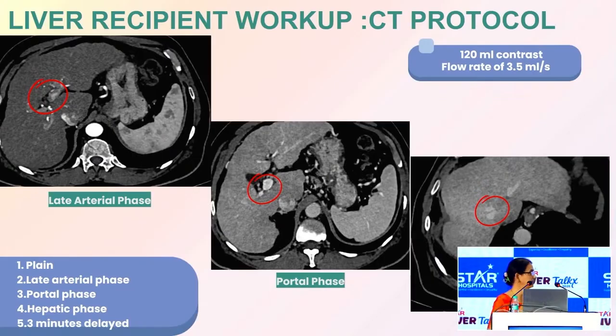Now this is how you work up a liver recipient. This is what we've been following at Global. I think it's probably the most important slide of my talk, because everything in terms of liver recipient workup is all to do with timing.